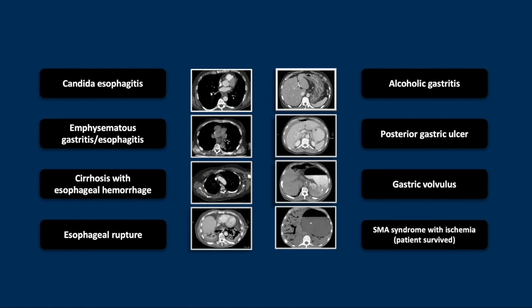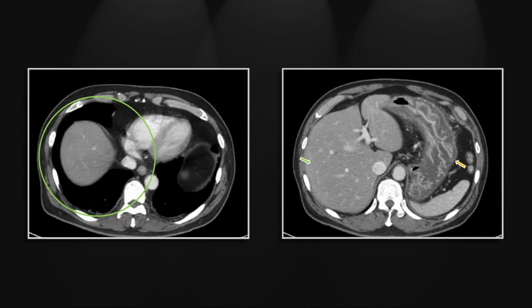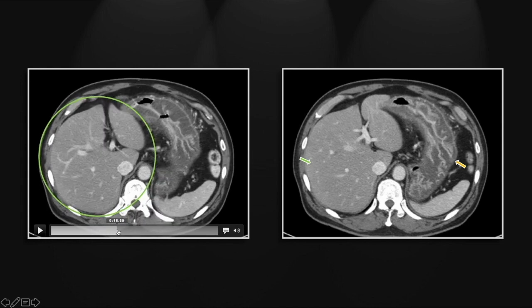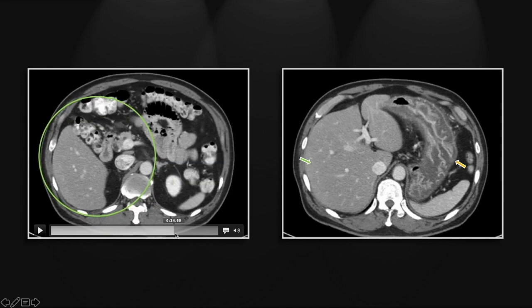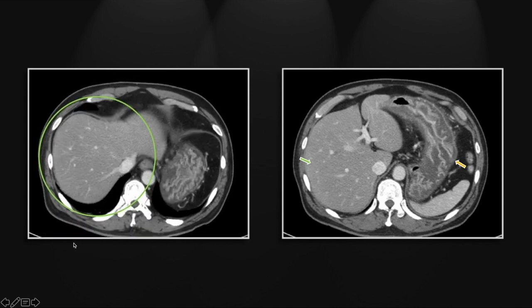Our next case is of alcoholic gastritis. You can obviously appreciate significant fatty infiltration of the liver and marked hypodense wall thickening throughout the stomach, also with mucosal enhancement suggestive of inflammation. Let's first appreciate the fatty infiltration of the liver, which will give you the hint that this is most likely going to be alcoholic gastritis.